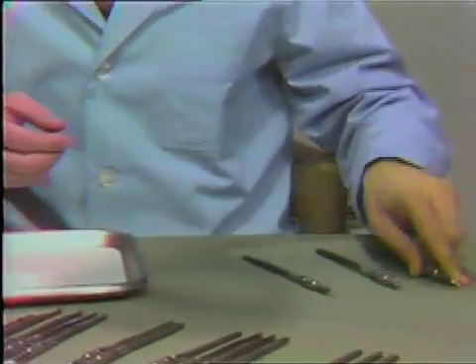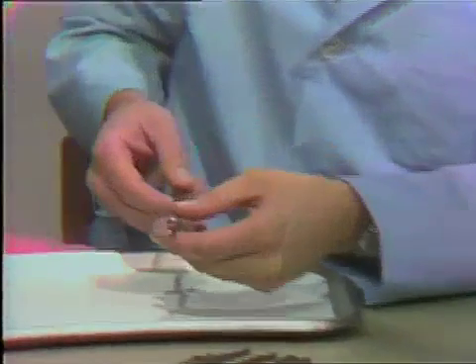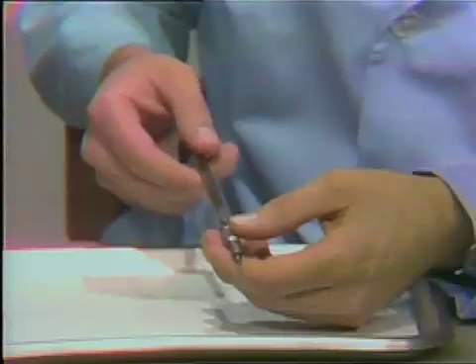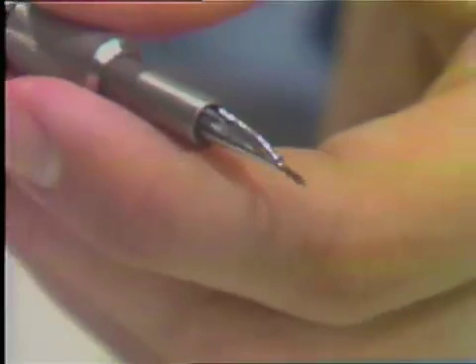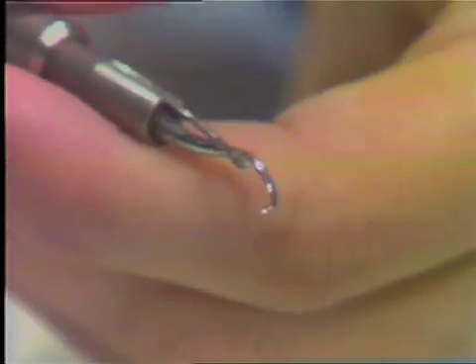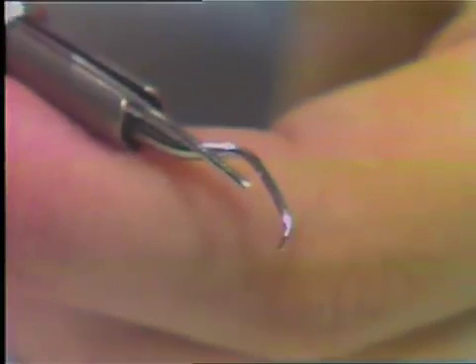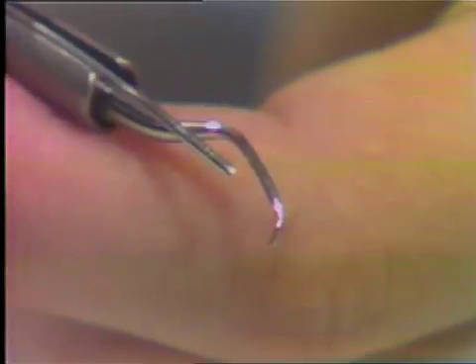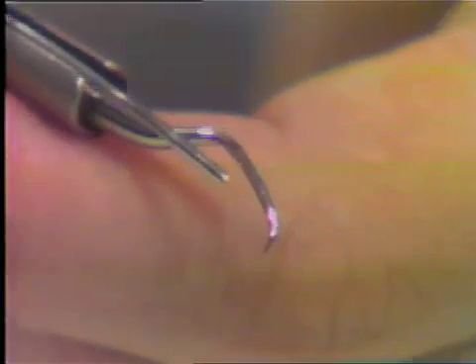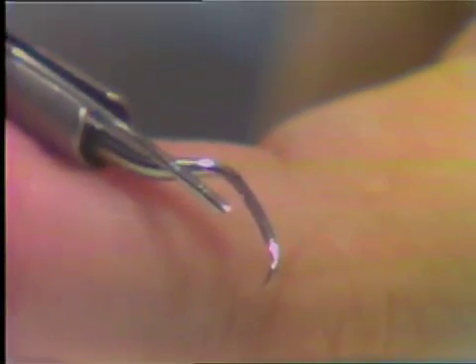The most universal tip for scaling both supra and subgingival interproximally in the posterior portion of the mouth is what we call the P10. In contrast to the P1 and P3, you do not use the tip of the instrument when scaling, but you use the side of the instrument. This is shaped very similar to the 13 and 14 curettes, or the 5 and 6 curettes, that you have.